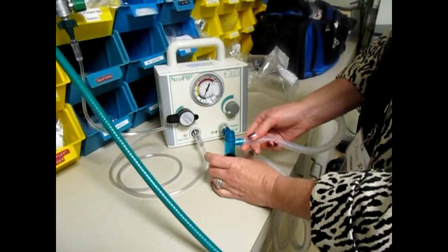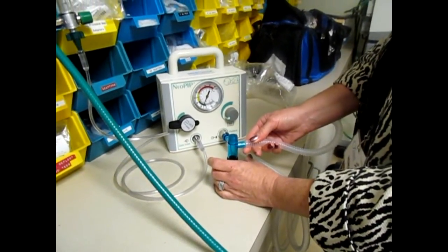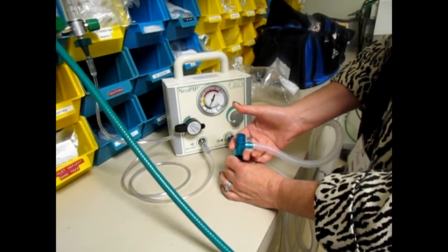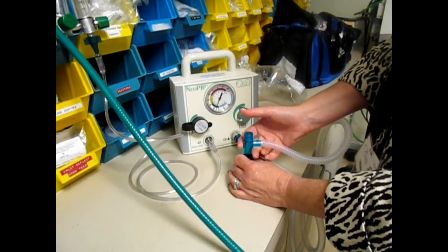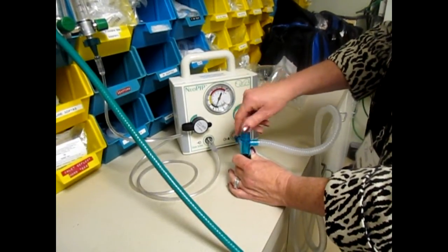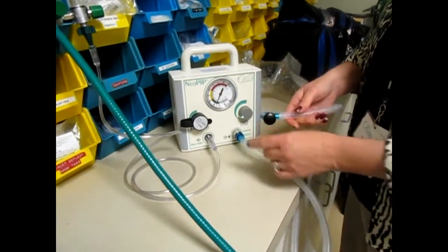That's all I need to do — sit on the mask and push a nice tight seal down around the mask. So again, inhale, exhale, inhale, exhale. This changes your PIP. This changes your PEEP. That's all there is to it.